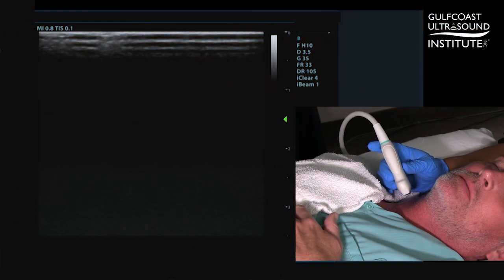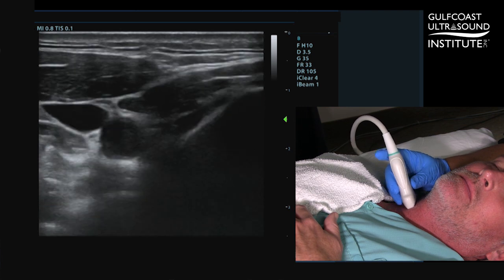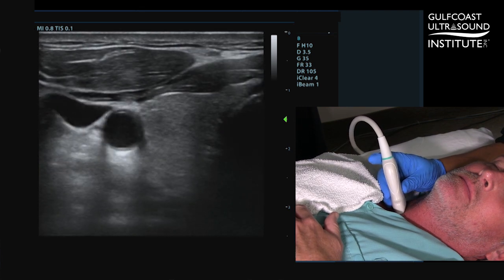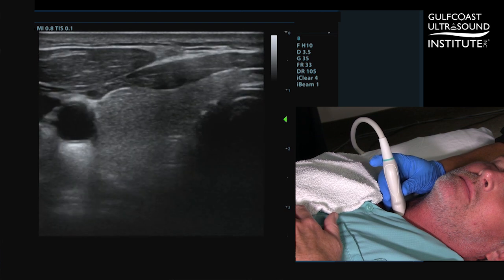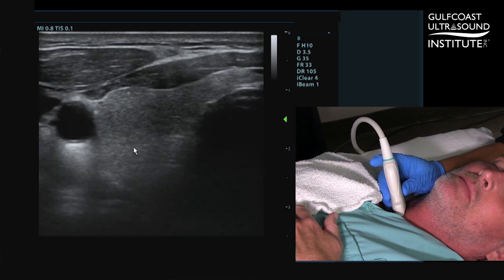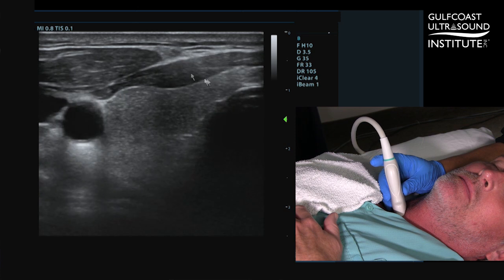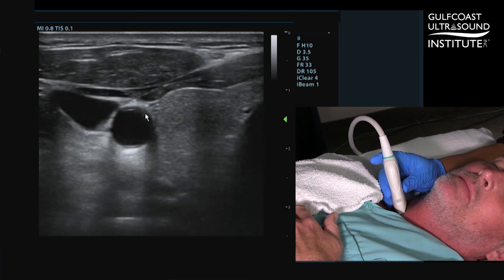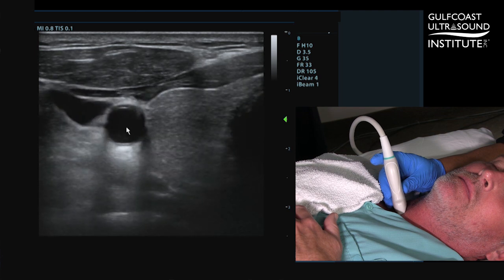The first step to demonstrating the vertebral artery is being able to identify the common carotid artery. I like to place the transducer in the transverse plane on the neck at about the level of the thyroid. As you see here, we have the trachea, the mid-lobe of the thyroid, the internal jugular vein, and in between those is the common carotid artery.